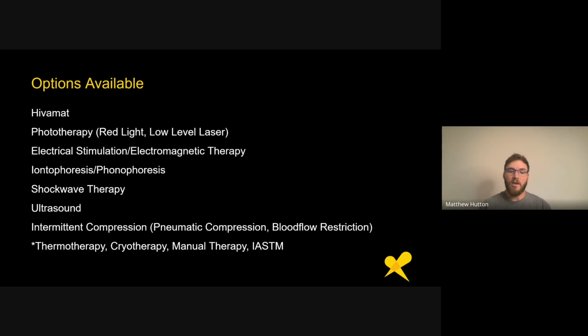Basically, you're taking, what would you call it? A mechanical head. And so we used to call it the jackhammer. And so basically it's driving this mechanical head through a really compressed chamber. And so you're sending these mechanical waves through the transducer to then kind of transmit into the body. And so it basically feels like you're getting electrical signal. It feels kind of like you're getting shocked. But in reality, there's nothing electrical going on here. You're actually using mechanical signal to then stimulate these different tissues.